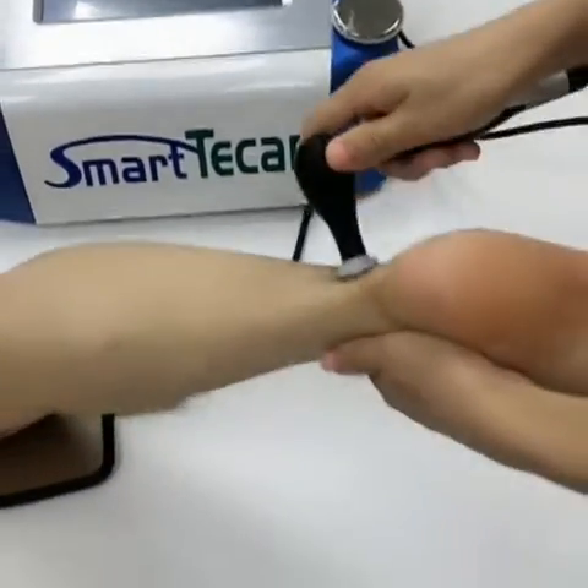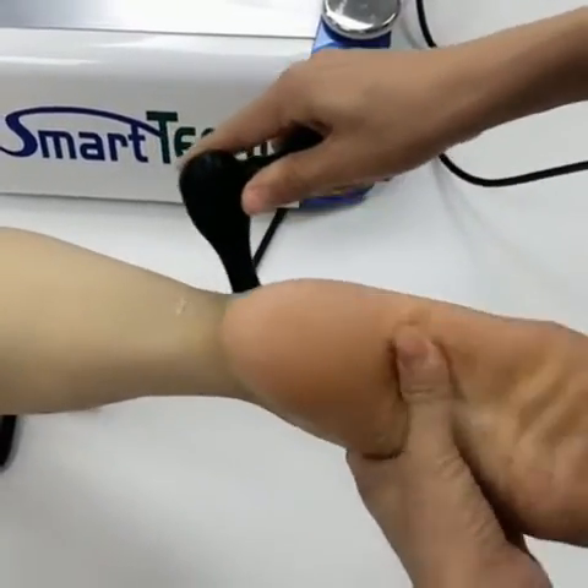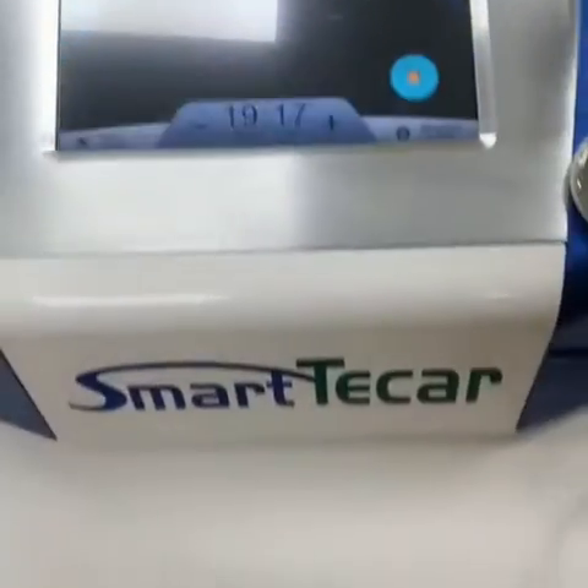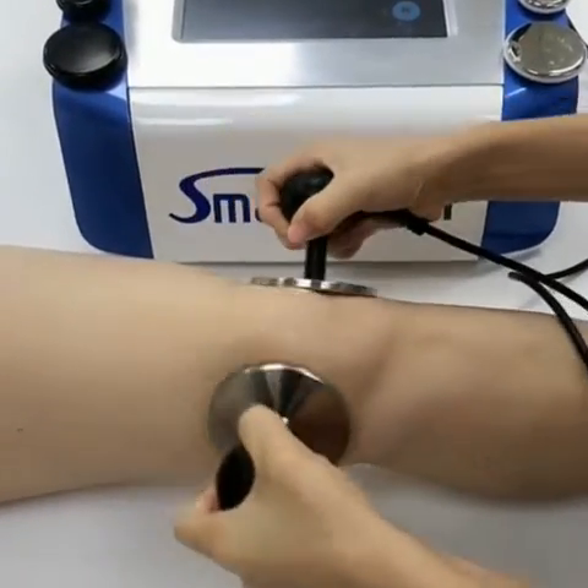It can be used in different parts of the body. Now we change to the other handle. The two handles need to work together and do not need the electrode plate.